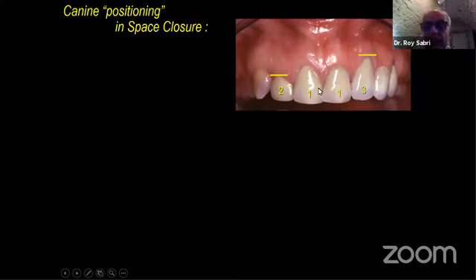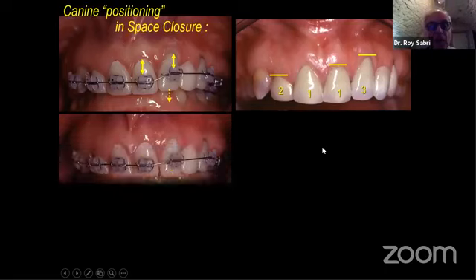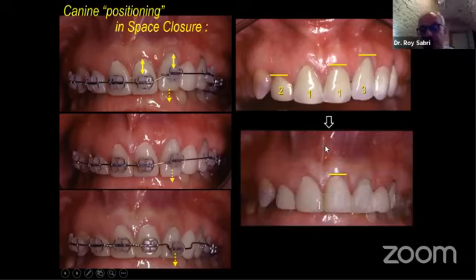So what I did is I extruded the canine. My brackets were positioned according to the gingival level, and I reduced the edge till I got even some overcorrection. And now, this is a temporary crown, and now a temporary bridge, and now the dentist can do his work and he can do a small gingivectomy on the existing lateral.